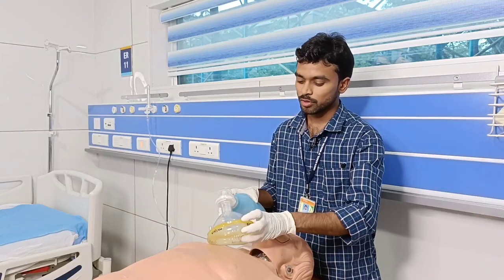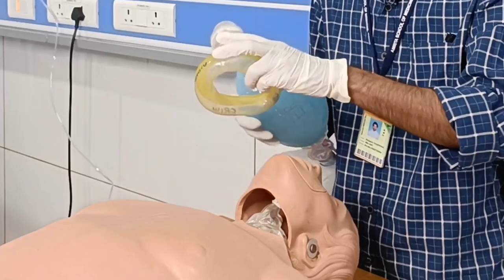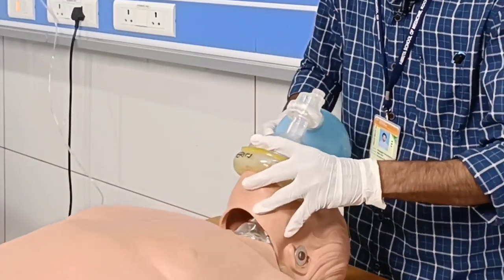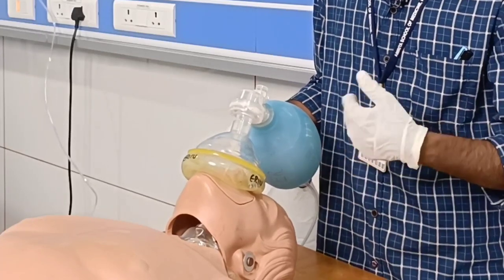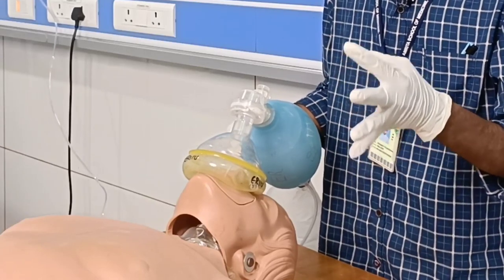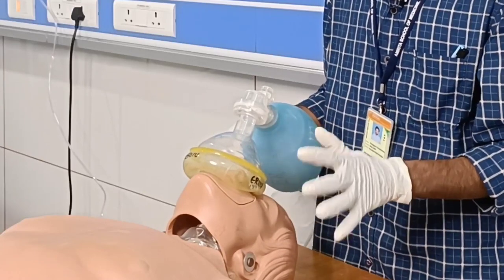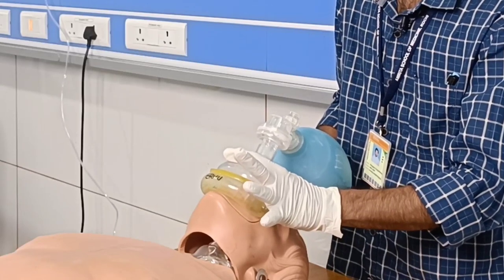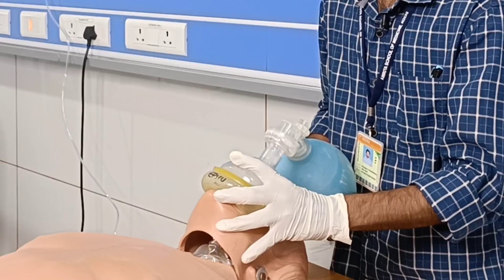For the bag mask ventilation procedure, open the airway, then select an appropriately sized face mask. In one-hand ventilation, the thumb and index finger form a C-shape on the mask, while the remaining three fingers — especially the little finger — lift the jaw. Ventilate the patient. Adequate chest rise confirms you are delivering adequate tidal volume of 6 to 8 ml per kg body weight. Chest rise is the correct indicator for adequate bag mask ventilation.